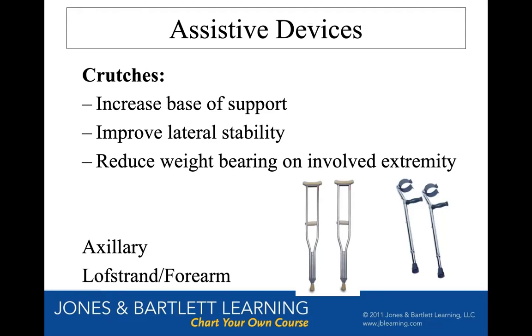It's not really the most effective way for an adult to get around, especially on a college campus, especially when you have to get around U of H like he was trying to. He was going through a walker every 6 months because the U of H campus was just so hard on his equipment. Well, I trained him on Lofstrand crutches, and it totally improved his independence because he didn't have to worry.